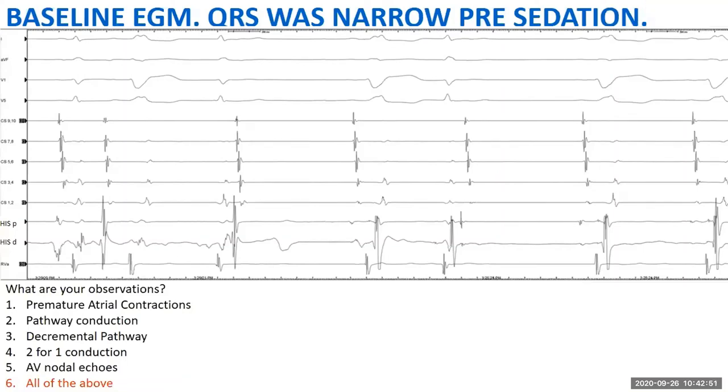So honestly, I think also that with EGMs it's very difficult to come to definite conclusions based on one EGM. And naturally, a full study needs to be performed to establish consistency also, just as a stretch to what Prof. Ching said.